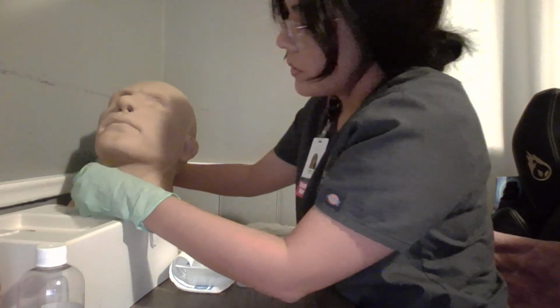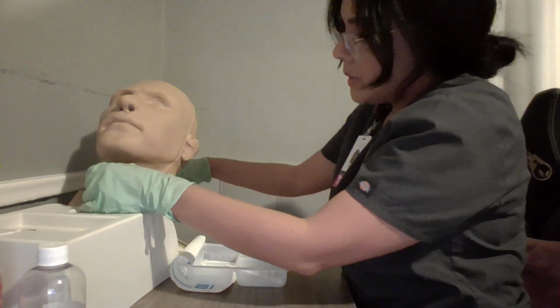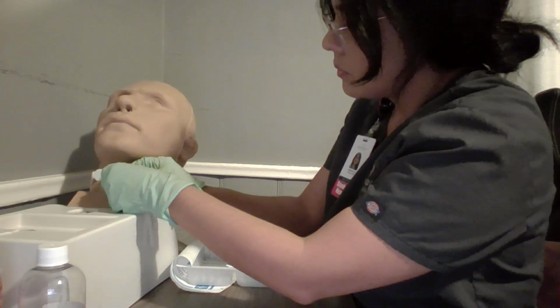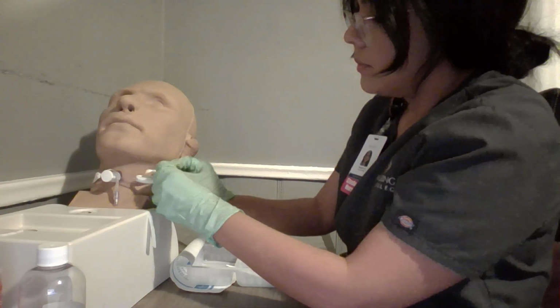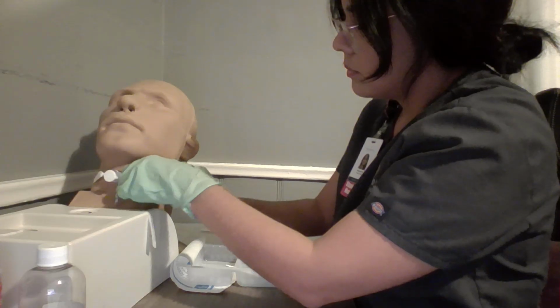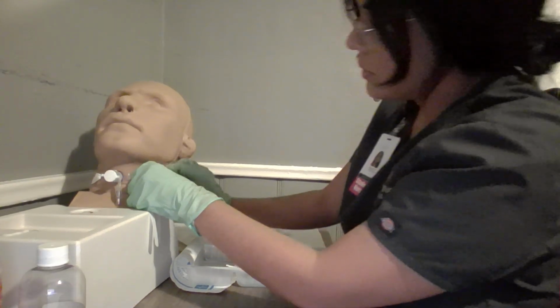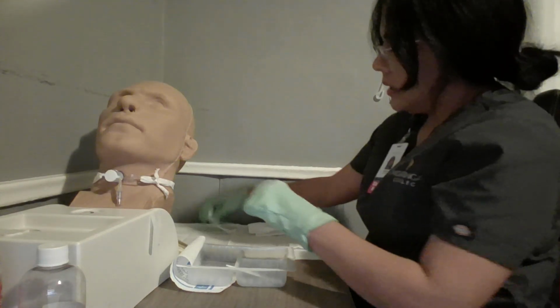And when I wrap the strip around my patient's neck, I want to make sure there are no twists or knots because this may cause skin irritation. I will continue here to tie the knot. I want to make sure the knot is not too tight here. I will insert two fingers here to make sure the knot is not too tight. And now I will place a new dressing.